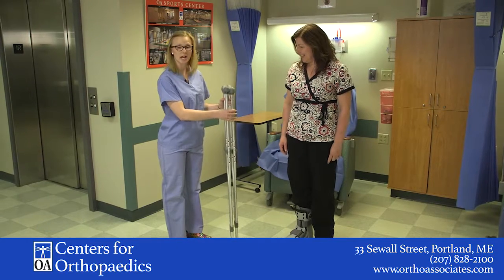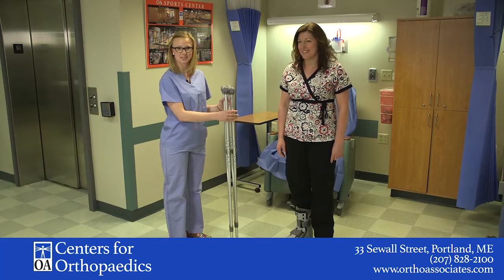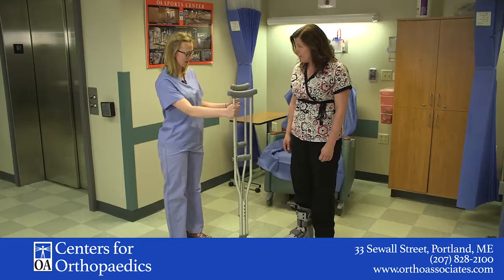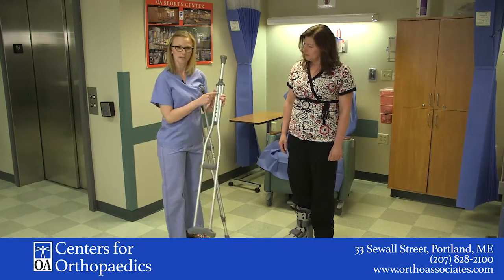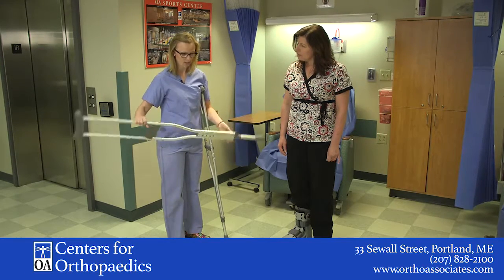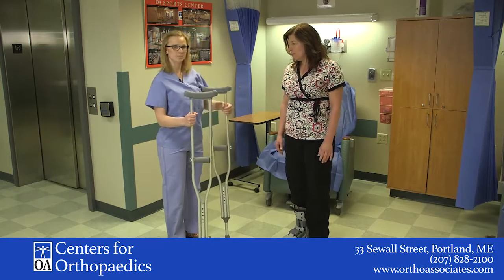Today we are going to be demonstrating how to fit crutches. My name is Heidi and I work for OA Centers for Orthopedics. We need to fit some crutches to Donna today. Typically on the crutches it will give you a little bit of help and it says the size based on the height of the person. These are at 5'6 right now, so we're going to fit these to Donna and see if the size is appropriate.